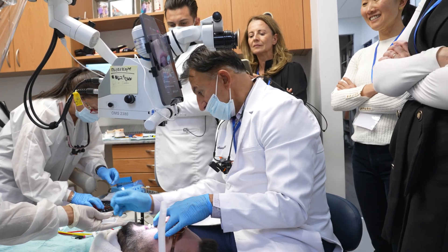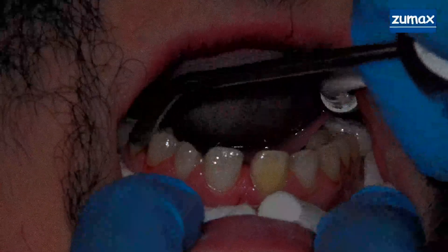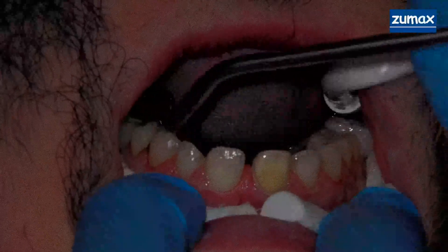So Tori says hello. We're doing a little bit of air dry here. Do not cure the 2FL.